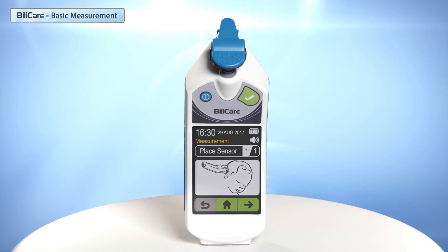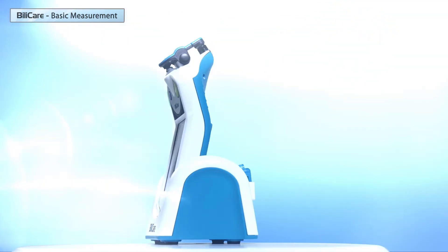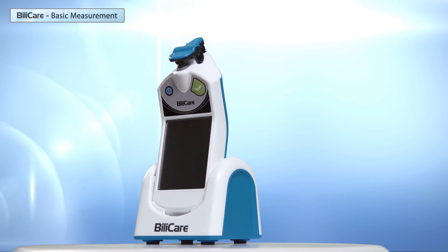There are three options to return to the home screen. Press the next button, or the home button, or use the green button on the device. BILICARE is now ready for another measurement.